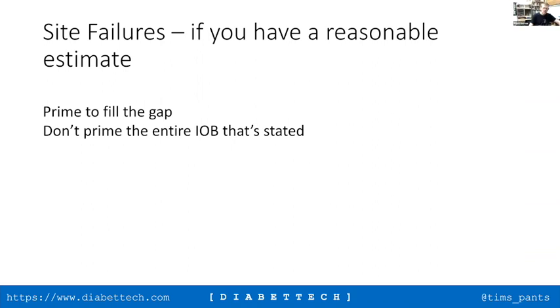Yeah. And that, unfortunately, is just the sight of living with a pump. One of the problems I found with occlusions: if someone was to say have a 2-unit bolus an hour ago and then you decided it didn't work, oh, I'll put an extra 2 units in now, everything's been shifted by 2 hours. So if you prime the extra amount to say, oh, it's missing, so I'll give it the extra units, those units are working on a different time scale and everything gets a little bit messy.